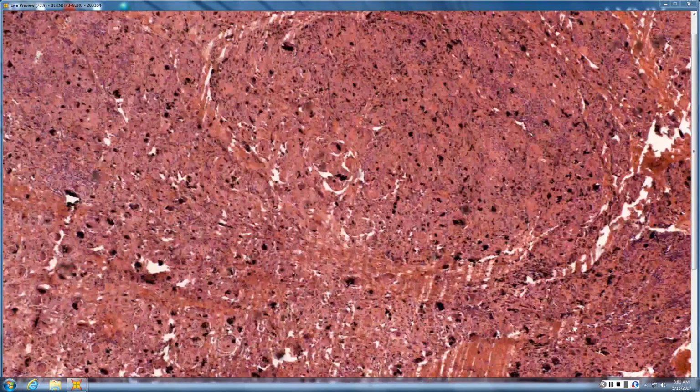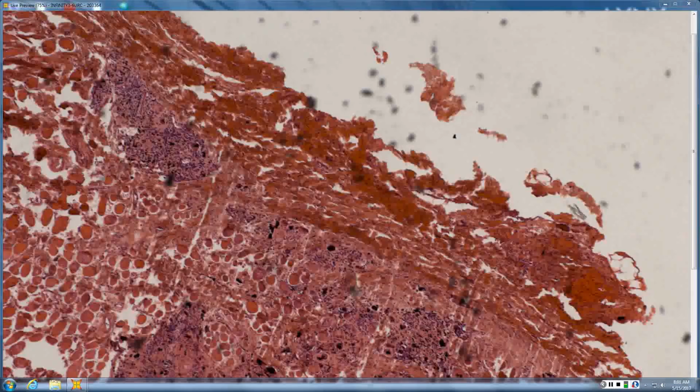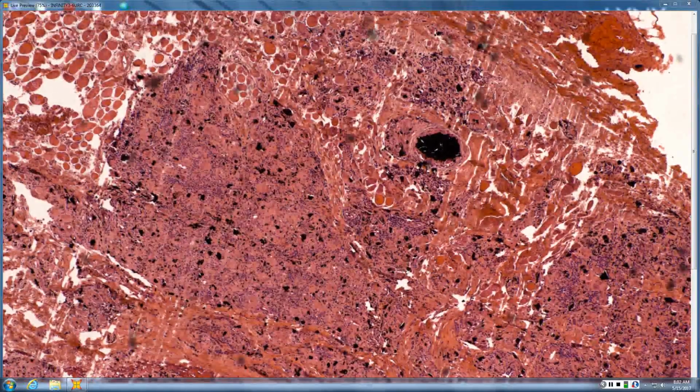Again, lots of pigment down into muscle. So more like a graphite or traumatic tattoo. Exactly. It's the sort of thing you could see with a gun blast. In this case, it was a vicious attack with a number 2 pencil, which can also give you a graphite tattoo.